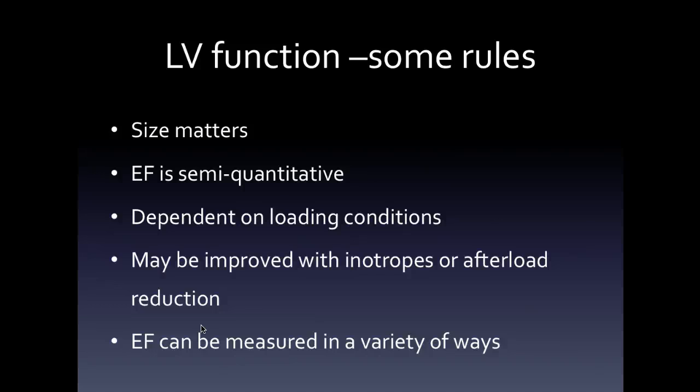One thing that I think we all know looking after critically ill patients, but sometimes people out there don't realise, is that the ejection fraction is dependent on loading conditions. It's not just a fixed number. So depending on what your systolic blood pressure is, your echo will look quite different. If somebody comes in with a hypertensive crisis and a blood pressure of 200 over 100, their LV function will look quite different from a blood pressure of 120 over 80. There's a marked difference between the two.